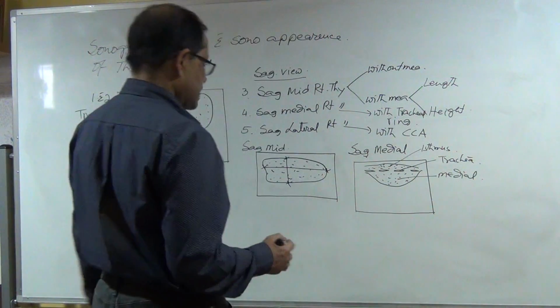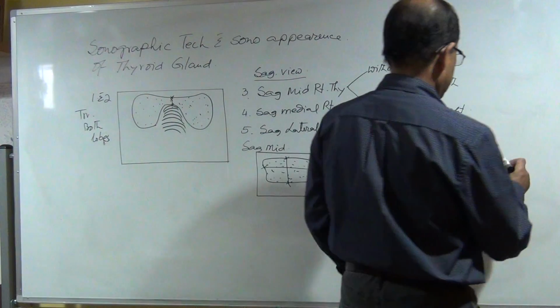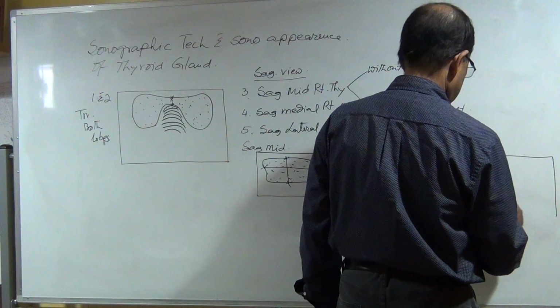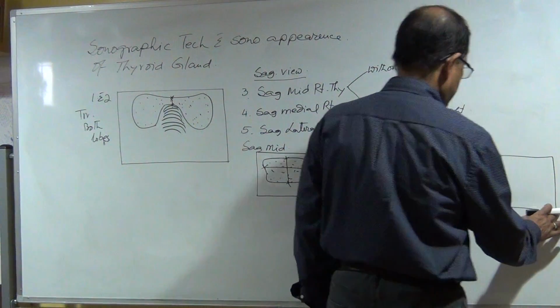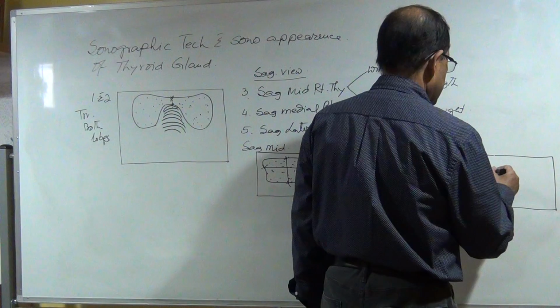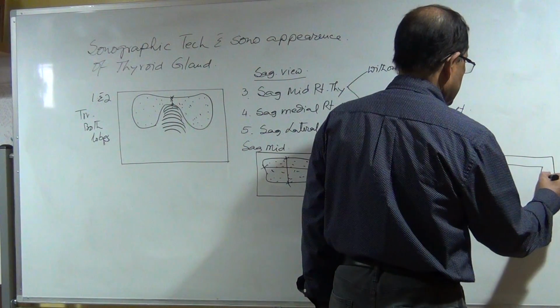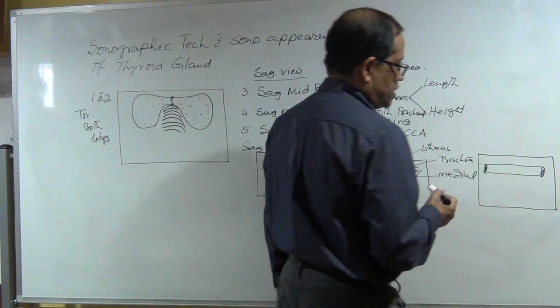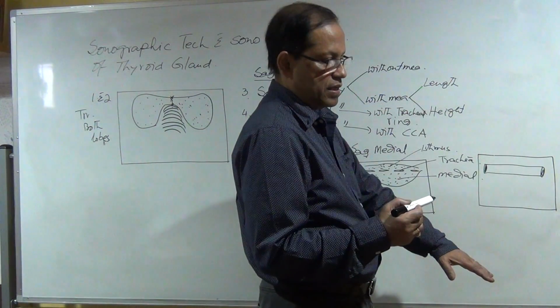Okay? And the lateral, you will see the carotid artery here. You will see the carotid artery. That is your landmark.